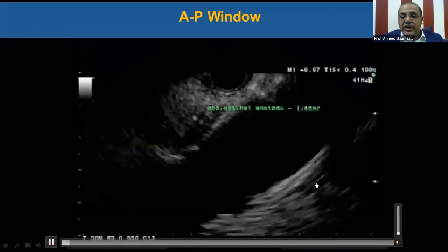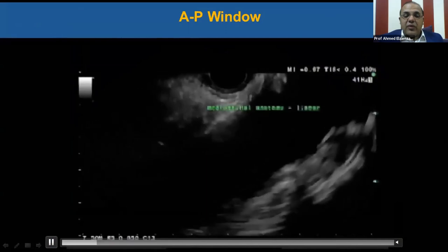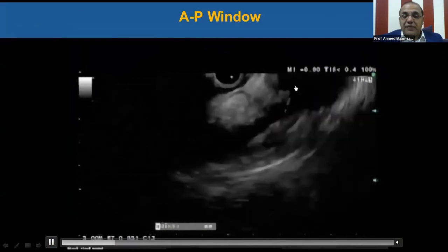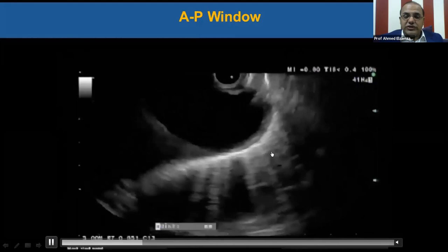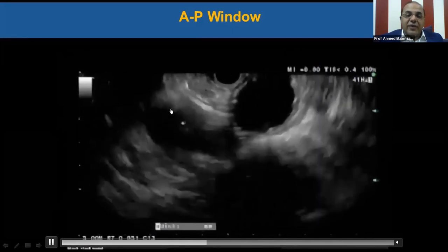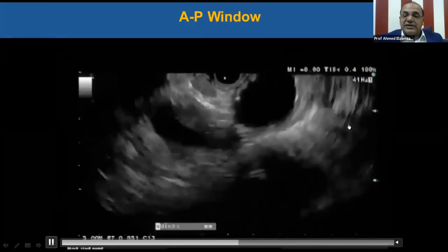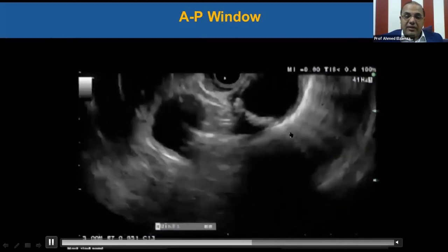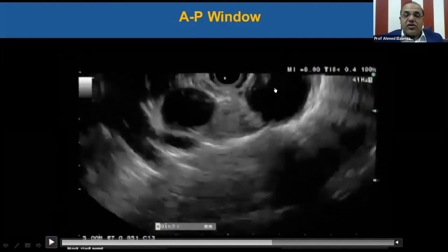This video shows the aortopulmonary window. This is the descending aorta. We withdraw the scope until we reach the upper end point, then clockwise rotation to trace the arch of aorta. This is the arch of aorta on the right and the left pulmonary artery on the left. And these are lymph node stations 4L, 5, 6, and 10L — four lymph node stations at this important location. The aortic arch on one side and the right pulmonary artery on the other: stations 4L, 5, 6, and 10L.